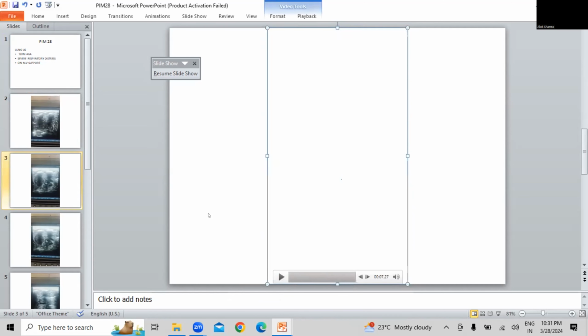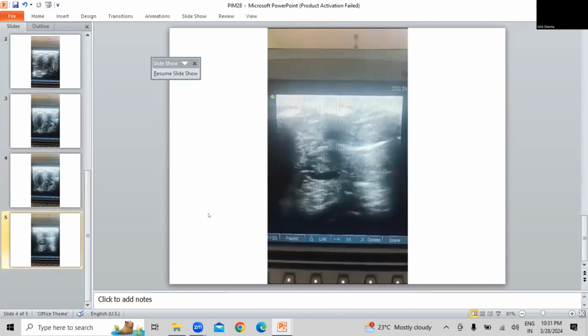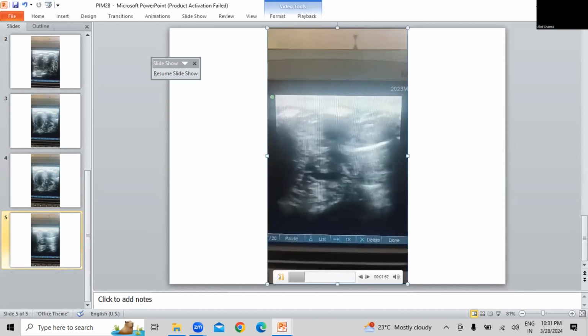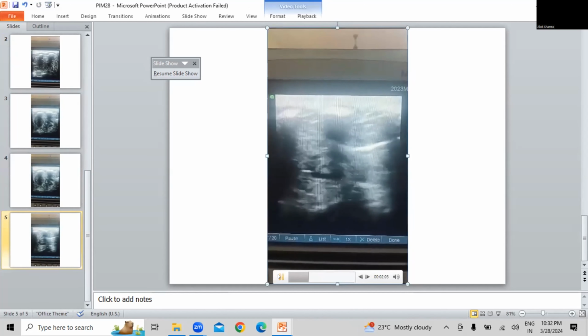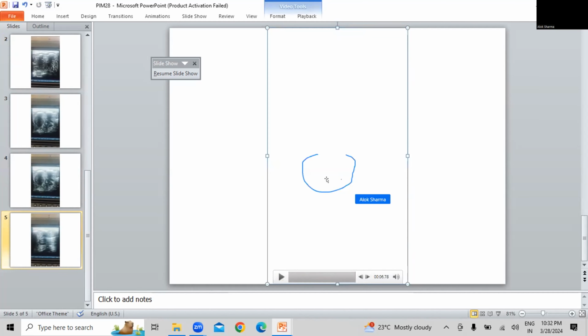What I'd say, just for everybody, is that sometimes you will not get visible loops because you've decompressed, taken air out, and it gives you that kind of appearance that can confuse you with tissue signs. But the one thing that's a giveaway for me is I can see peristalsis. Can you see peristalsis just in the center? I'll just highlight that for you. There's peristalsis over here. So I'd be a little bit worried that you've got a diaphragmatic hernia.